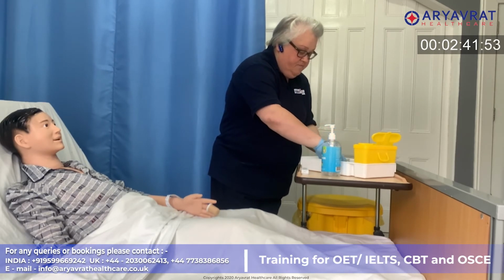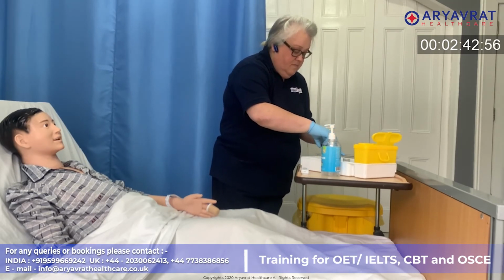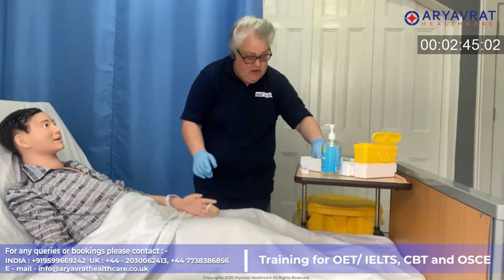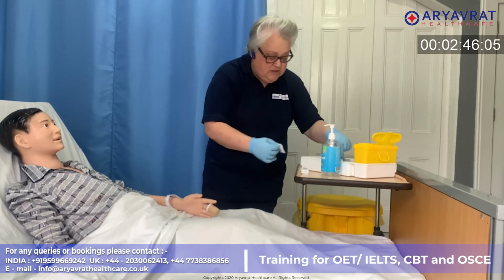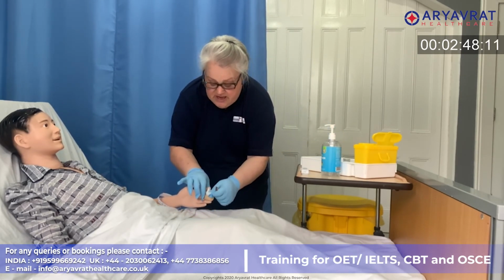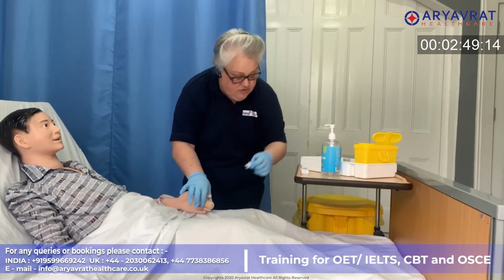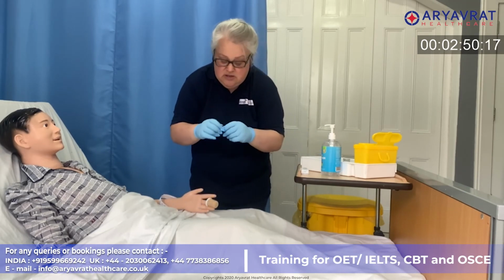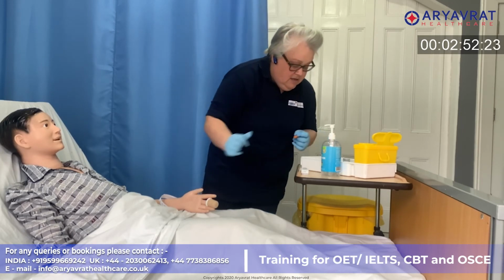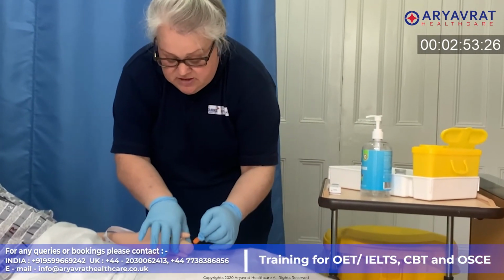So I'm going to place that in here, and I'm going to just use one of these gauzes just to make sure the tip of your finger, I'm going to use this finger, is that okay? Okay. Is dry, and twist, oh, it went off. Twist in the end here, and I'm going to prick your finger.